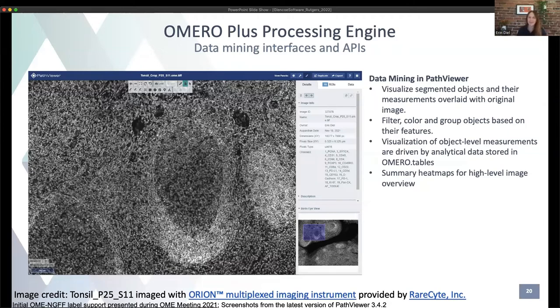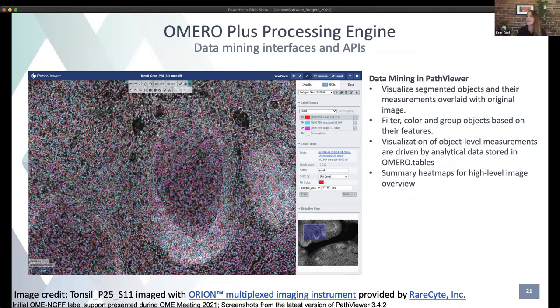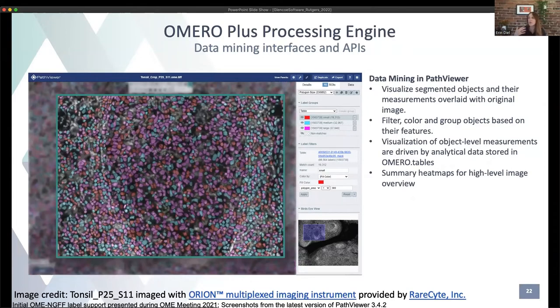In PathViewer we're supporting a data mining workflow within the tissue context. You might want to visualize segmented objects overlaid with the original image — here that's nuclear segmentation overlaid on a grayscale image from a rare ORION instrument, which allows highly multiplex acquisitions. You can filter or color those objects based on calculated features — here they're color-coded by area into three groups. You could use more interesting classification workflows, coloring cells based on measurements of each object.